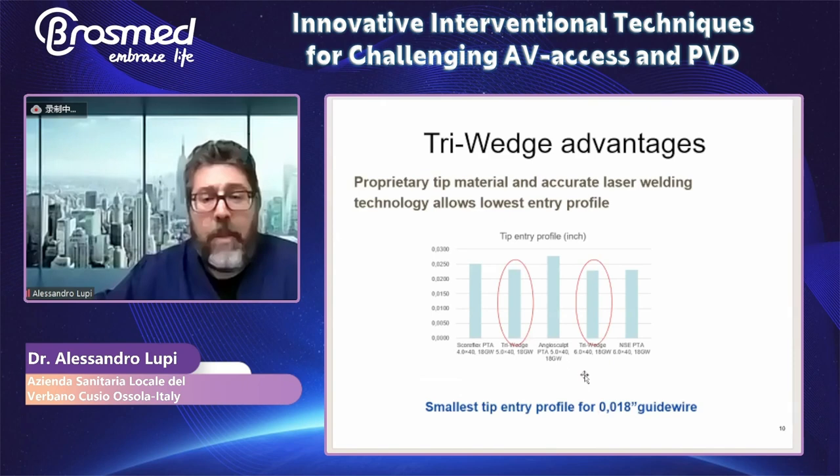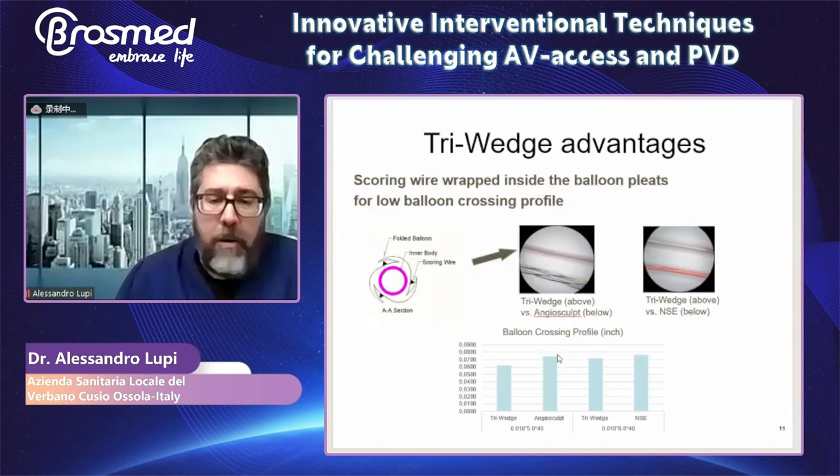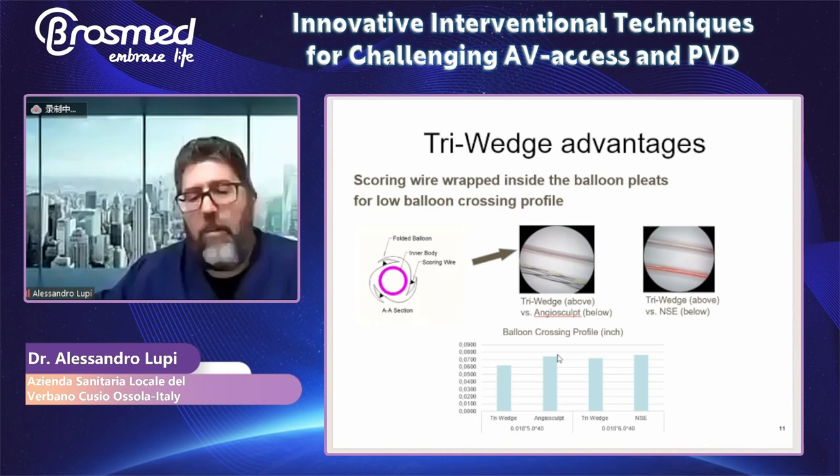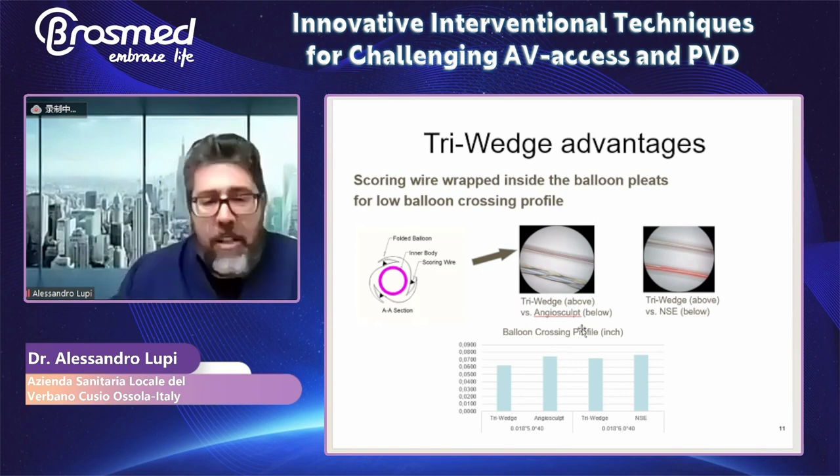Advantages are a very low entry profile and crossing profile that allow us to use it as a first attempt in very tight lesions, without using other balloons to make a way to advance the bulkier devices.